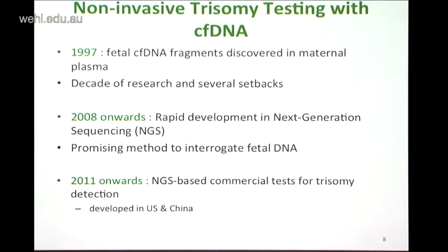And then they started looking into separating or enriching fetal DNA from the maternal DNA. And they found that they couldn't get one technique to be robust enough to translate into the clinic. So it wasn't until around 2007, 2008, when next-generation sequencing really started coming into play, that they looked into NGS as the technique to interrogate the fetal DNA and then translate it to the clinic.